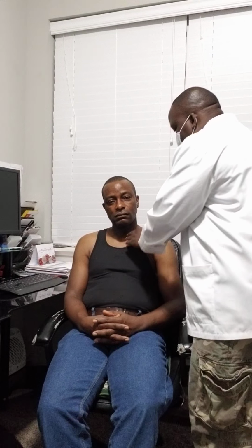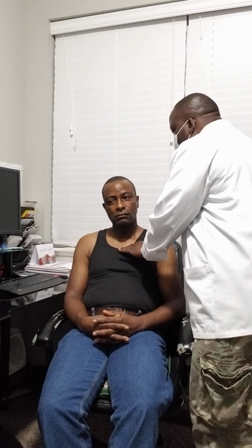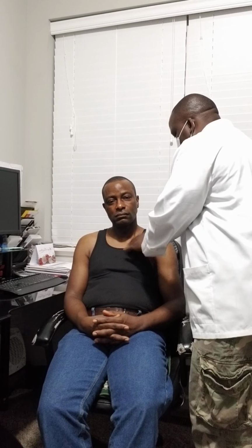Okay. Once you're done with that, the next thing that you have to do is you auscultate. You auscultate using the diaphragm of the stethoscope, and also using the bell of the stethoscope. Again, you identify where the sternum is, and you go down to the second right intercostal space, and that is where you find the aortic area or the aortic valve, and you are going to listen with the diaphragm.